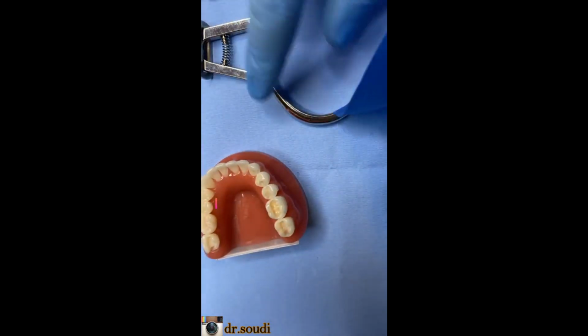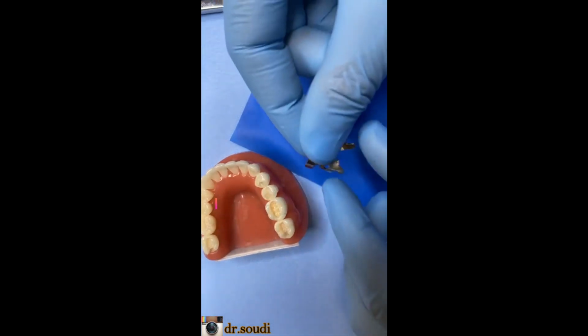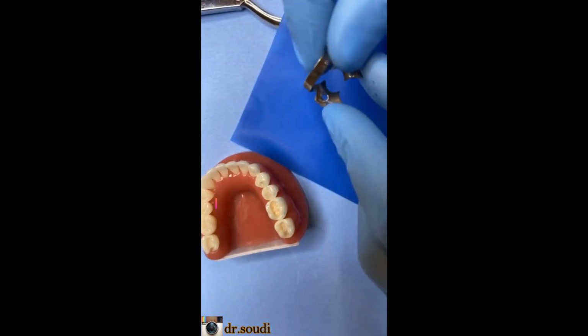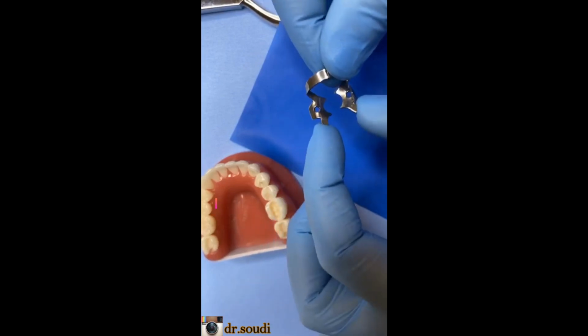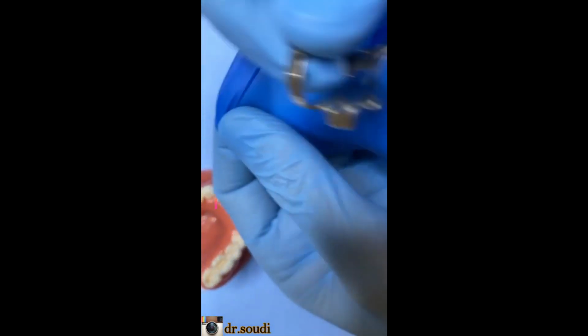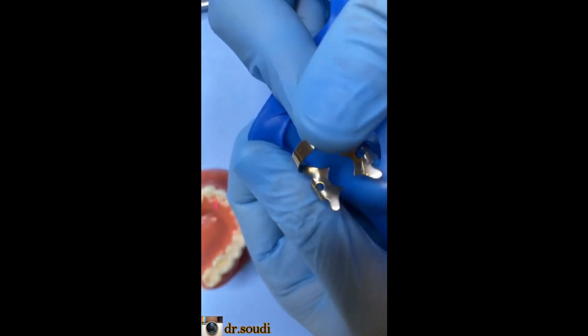We will be again back to English. The bow technique for the wingless clamp. Okay, if I have a winged clamp and I need to work with a winged clamp. Here we have a winged clamp. These are 2 central wings and those are the other 2 wings. Okay, so how will I place it? This technique is with sheet and the clamp. Okay, this is the clamp. For winged, now I have a wing, so I can apply the sheet to the wing. So like this, I need you to see.